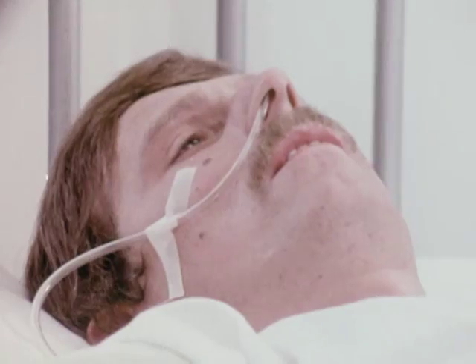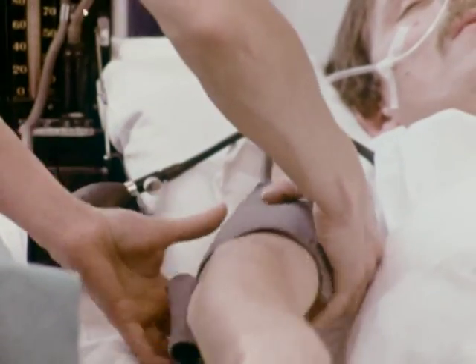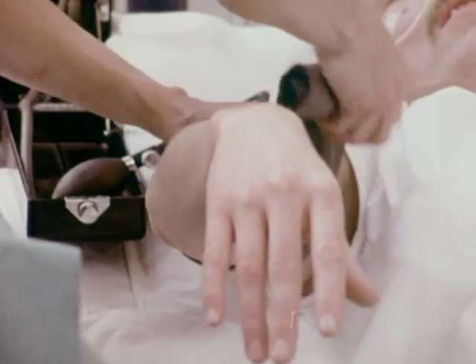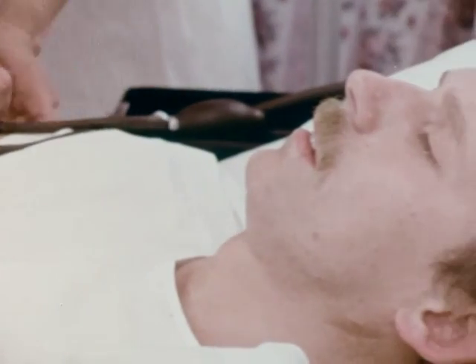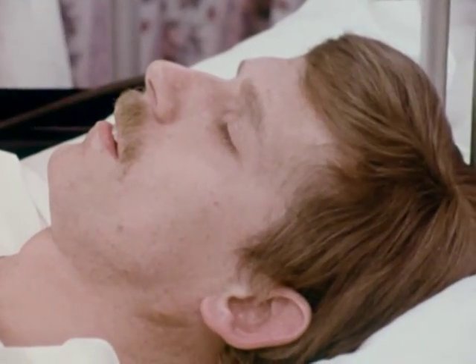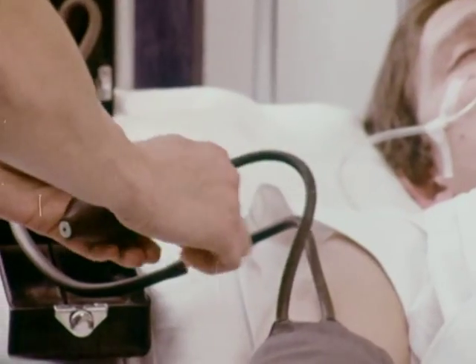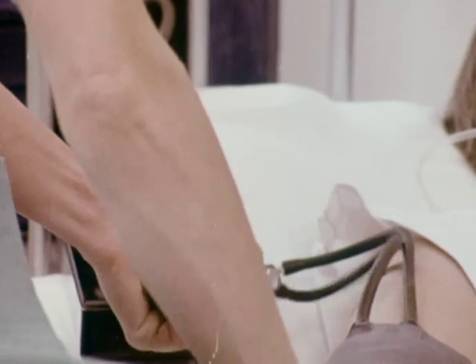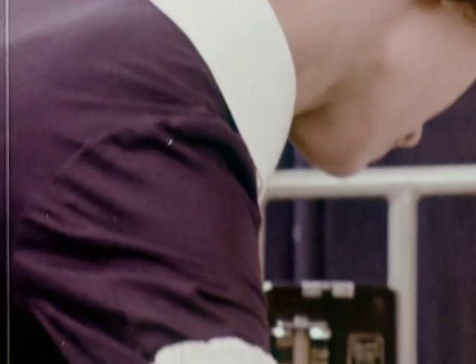It's often found that veins in the forearm are readily accessible if the arm is allowed to hang down for a time at a level below the heart, because this induces vein distension. If the veins stand out well, then manual compression will easily be sufficient to fill them. However, it's usually necessary to apply a tourniquet, which must be tightened just sufficiently to obstruct venous return without stopping the arterial flow.